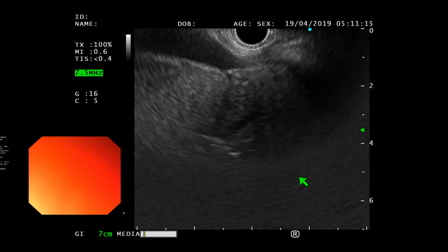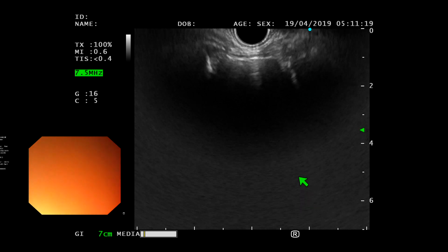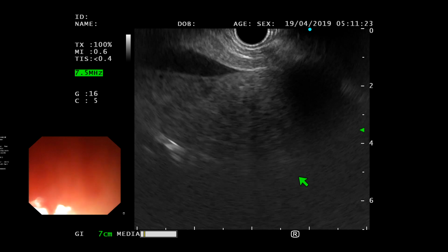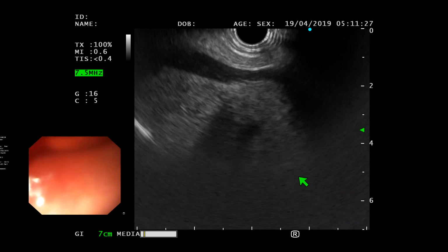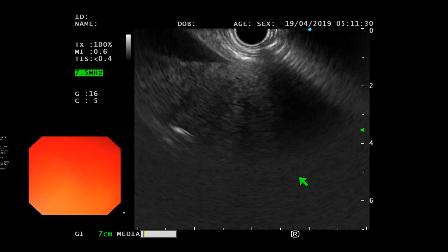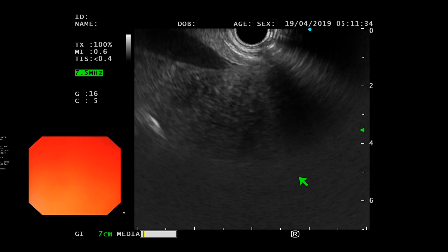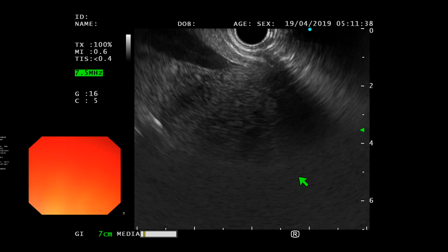So we know that we are not having a problem finding the aorta, right? Okay. Now to maintain that position is a problem. Which is fine, and you won't be the first trainee in the world who has an issue passing from the aorta to the GOJ, and we'll spend as much time as it needs, because what we want your brain to learn on this course is what maneuver my fingertips did, so the brain nerves have engaged.